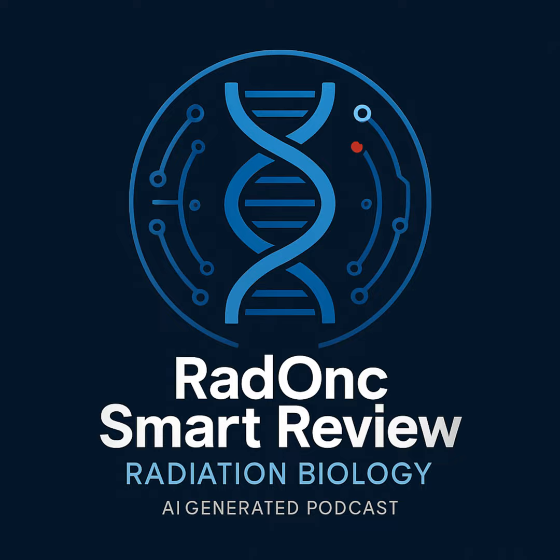Precisely. And then you collect millions, literally millions, of these coincidence events from all possible pairs of detectors around the ring from all angles. And the computer puts all those lines together. Yeah, using complex reconstruction algorithms again, it figures out where all those lines intersected most often and builds a 3D map showing where the tracer accumulated. Areas with lots of tracer, meaning lots of annihilations, show up as bright spots. That's incredibly clever, taking advantage of that 180-degree emission.